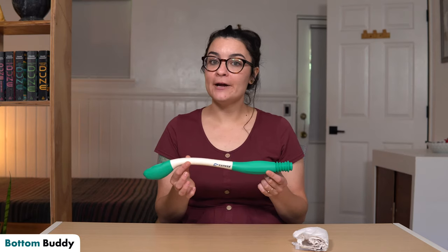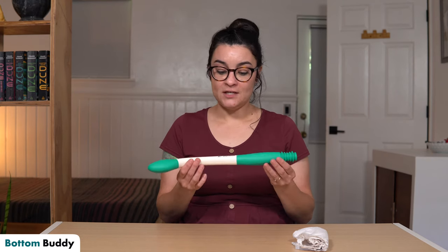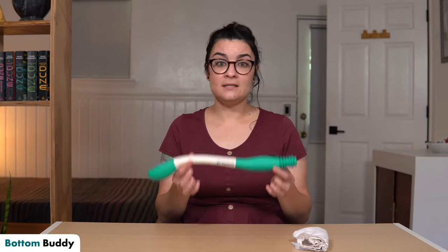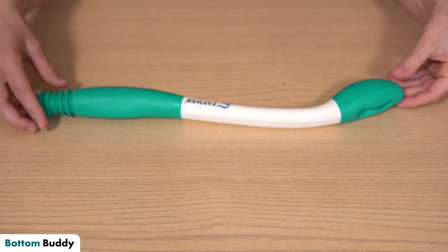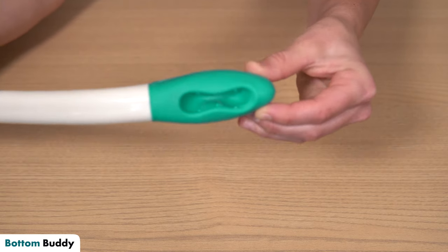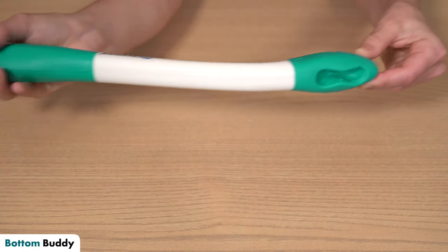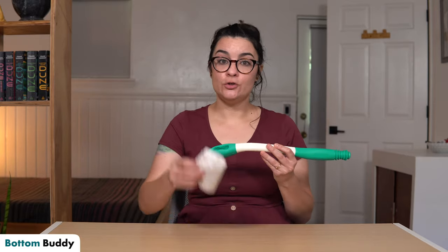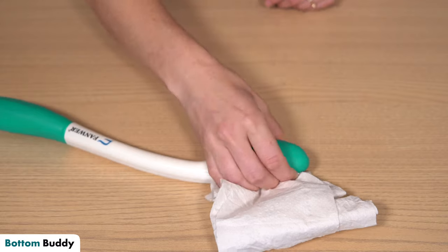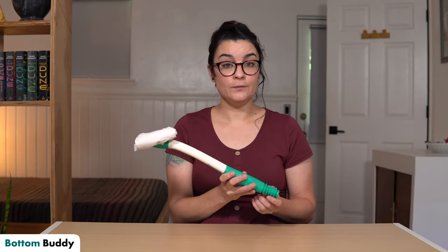The third tool I want to show you today is a Bottom Buddy. This one in particular isn't the brand name Bottom Buddy because those run around forty to fifty dollars US, which I think is a little bit ridiculous. This one is a generic brand called Fanwer, but it's the same concept as the original Bottom Buddy — just around eight to ten dollars versus forty to fifty. I like it because it's got a nice ergonomic design and silicone molding on the end where you put the toilet paper in and where you hold on to it, so it's going to grab and hold the toilet paper and give you a nice grip.